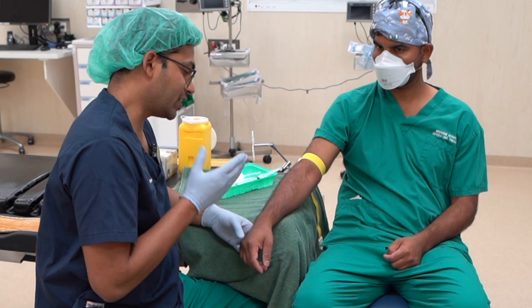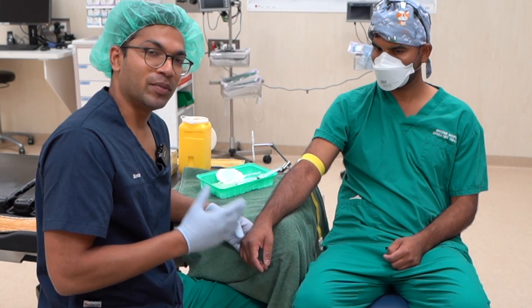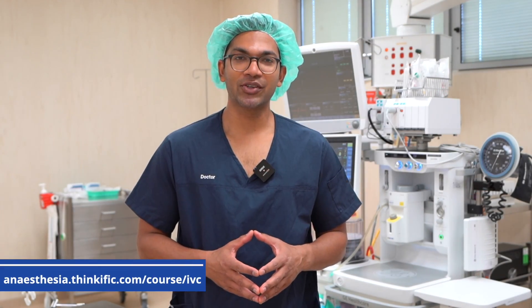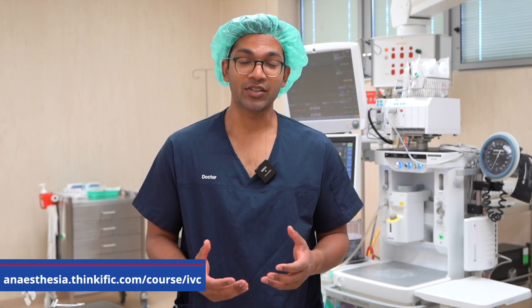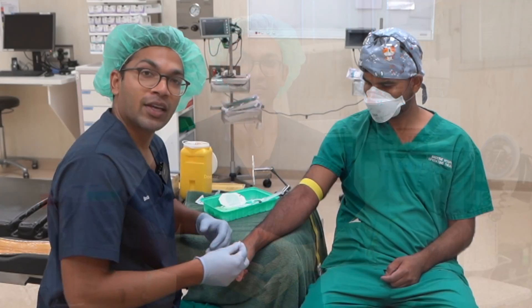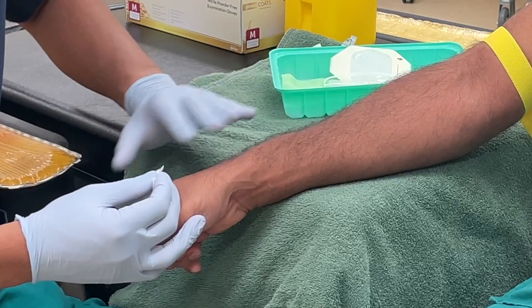Once I've identified a vein, the rest of the technique is just the same as usual. Please also check out my IV cannulation mastery course — over two hours of material covering all the knowledge and experience from my 20 or so years of practice. I'm going to demonstrate on a vein that's a little bit harder to see due to the darkness of the skin.